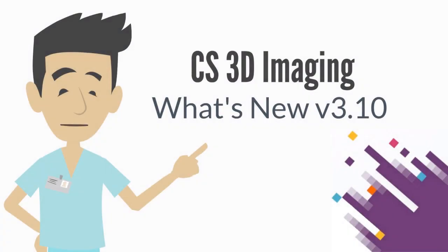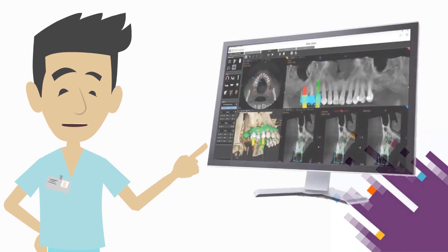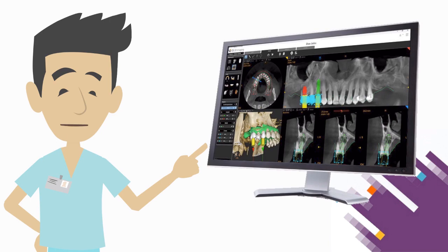Hello, today we are here to introduce new features and enhancements in CS3D imaging. New and improved features provide an easier, simpler, and more efficient imaging review and treatment planning management.